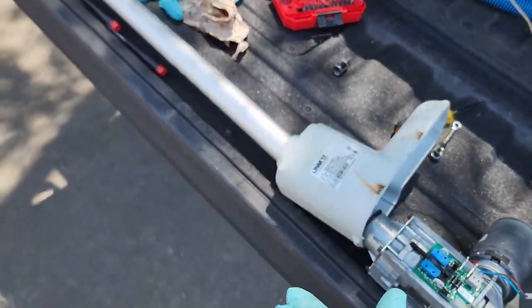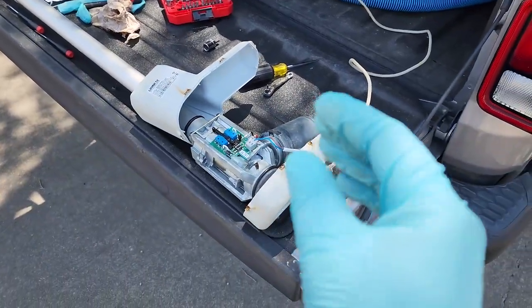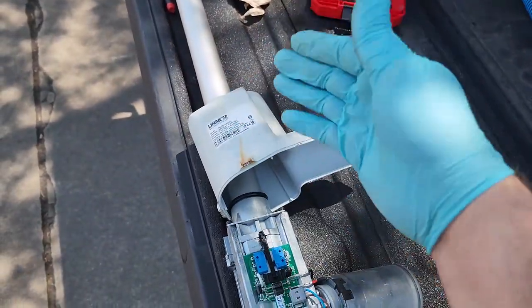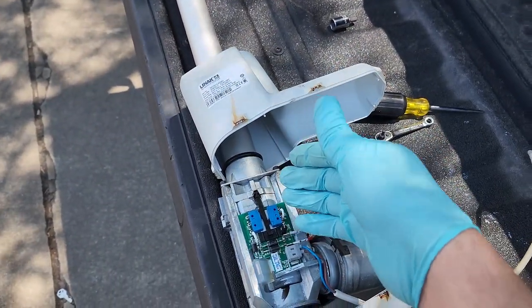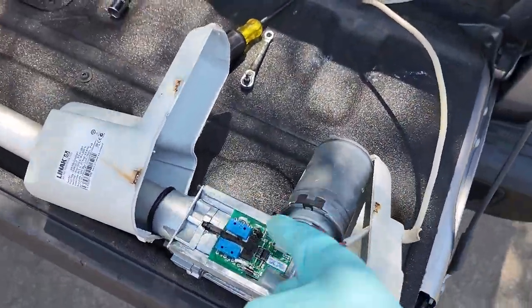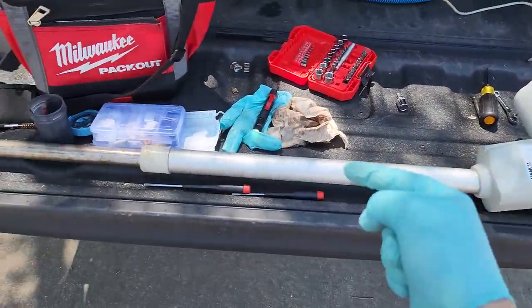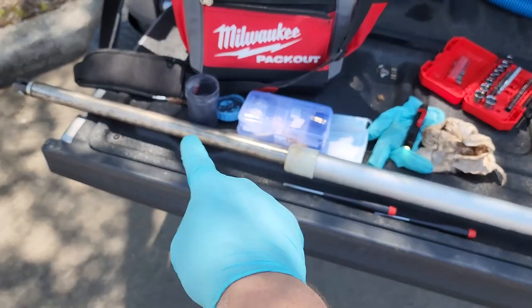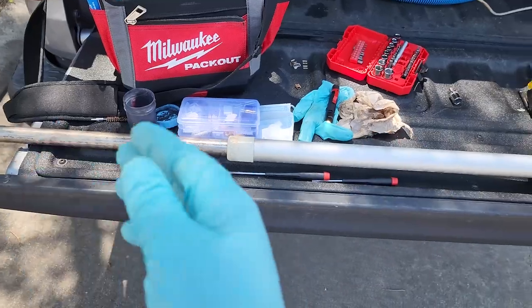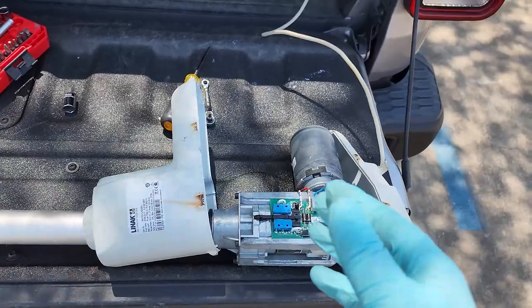A lot of that debris was able to scrape off, but I still am gonna try and get them to replace this in general, because it's just old, showing its age, and the wear and tear on it over the years, you know, I can't undo that. But I think I will get them back up and going right now. So I'm gonna finish putting this clamshell together, take it inside, and wipe it down. It's got extra grease on there right now, which is why it's got that dark hue to it. But I'll wipe it off and make sure that it's completely functioning and see how the pool lift works.